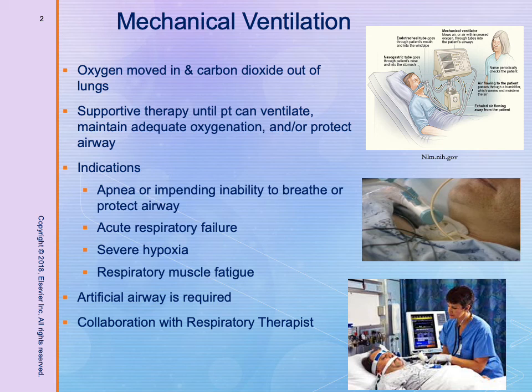Collaboration often occurs with respiratory therapy. They usually set up the ventilator, assess the patient at regular intervals, and they are a really good resource because they have extensive knowledge of the respiratory system since it is their specialty.